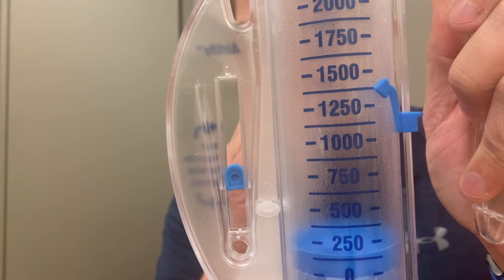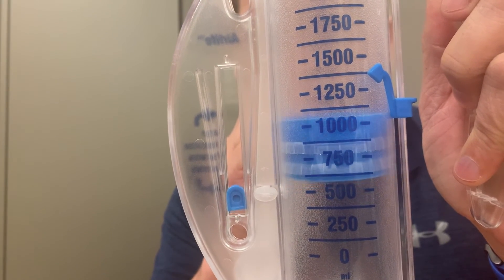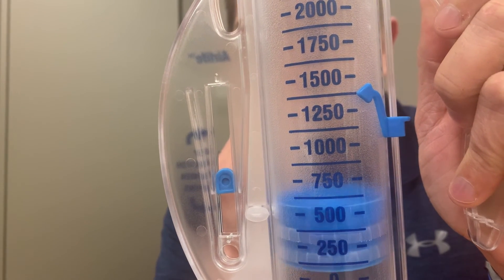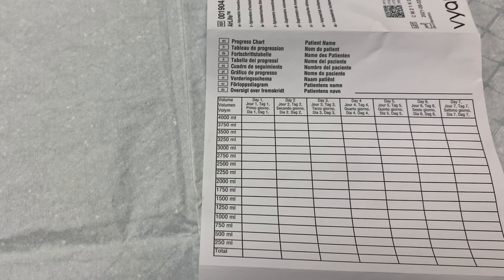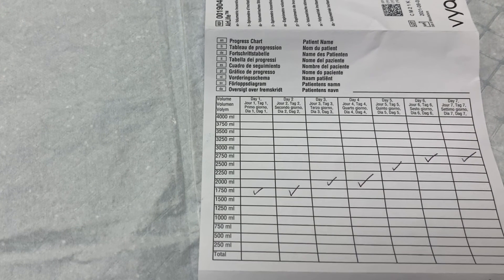Encourage them, especially if they are having a difficult time. If a doctor set a volume goal for the patient, it is not uncommon that they can't reach that goal initially, and that can be discouraging. If they continue to use the spirometer, they will see improvement and get closer to, and eventually reach and possibly exceed, that goal. It can be helpful to track volumes to help the patient and physician see improvement. The patient can use the included volume log to record their best performance each day for 7 days, and make sure they have the supplies to keep an accurate log.